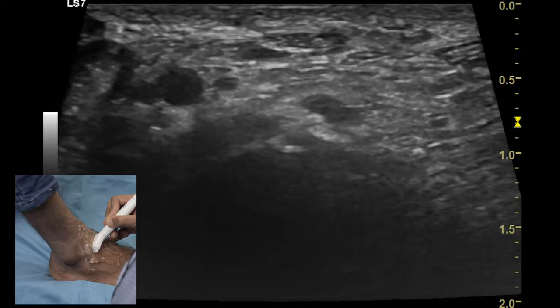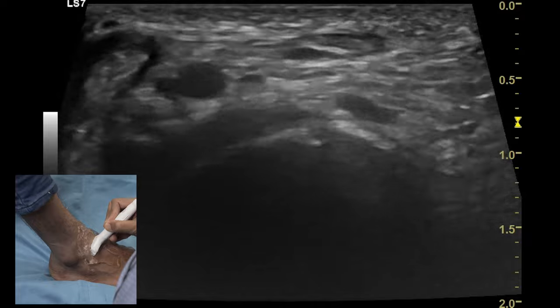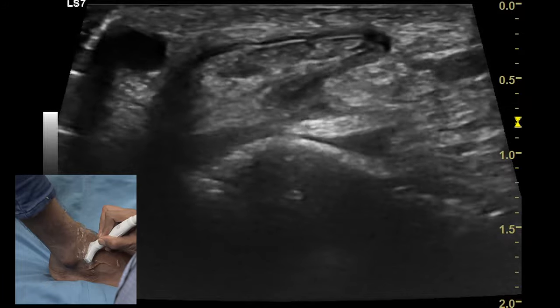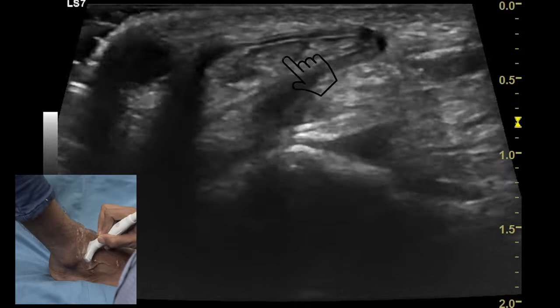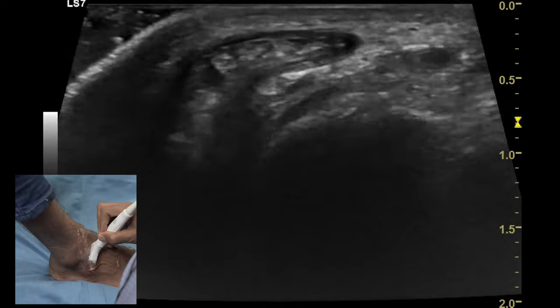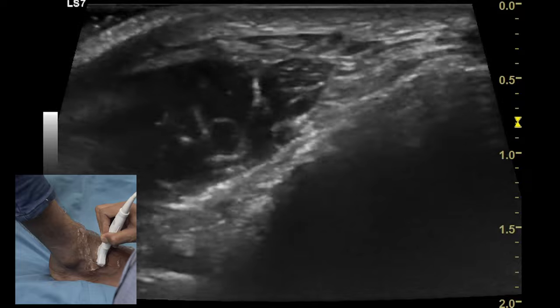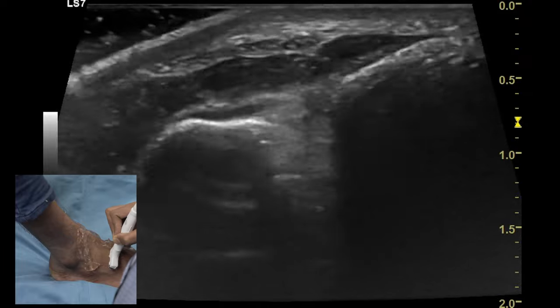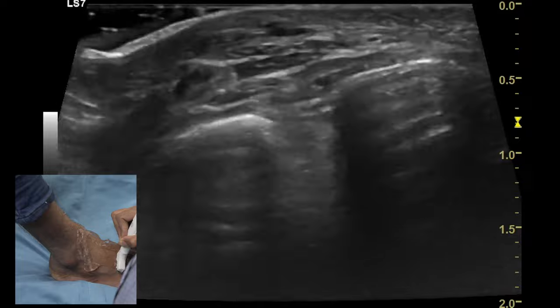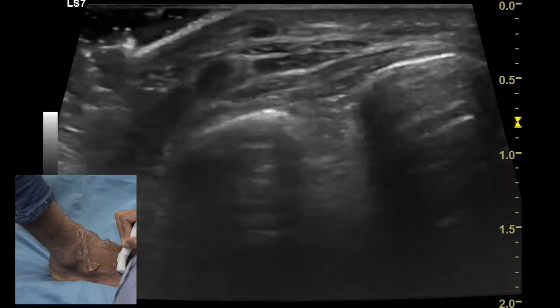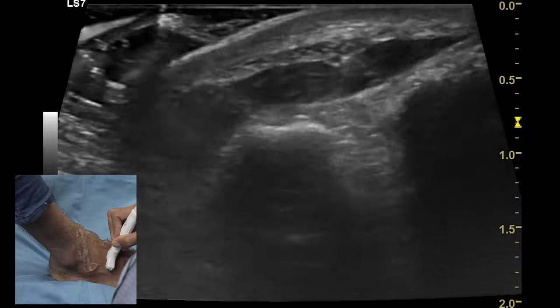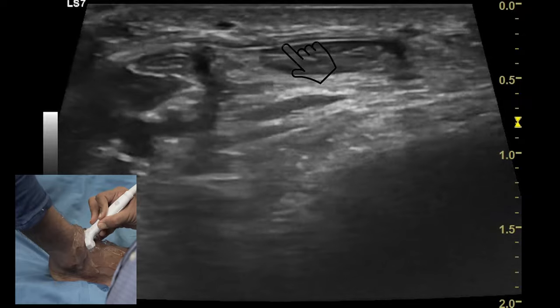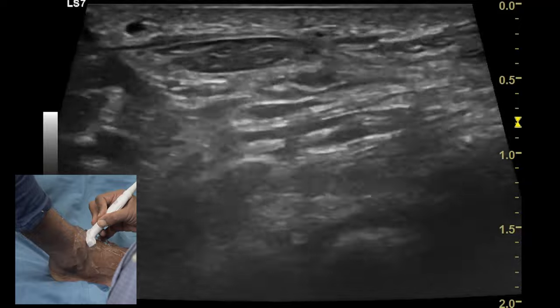Once the evaluation of the neurovascular structure on the anterior aspect of the joint is over, move the transducer more laterally and the tendon of the extensor digitorum longus can be identified, surrounded by the thick retinaculum and showing multiple slips. As you go distally, the slips are seen diverging towards each toe of the foot and dynamic examination can be performed by moving the toes in flexion and extension. Over the extensor tendon you can see a hypoechoic thin structure which shows evidence of anisotropy.